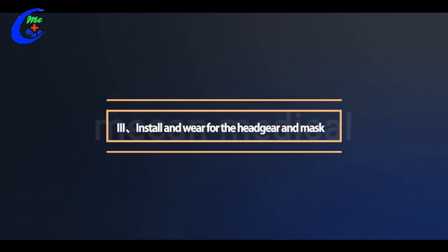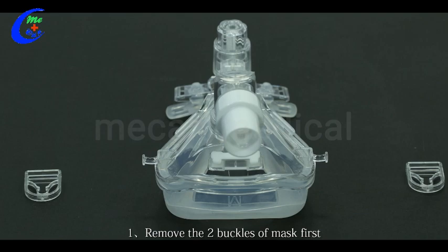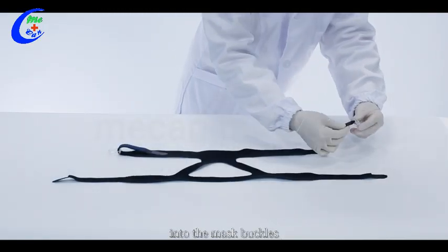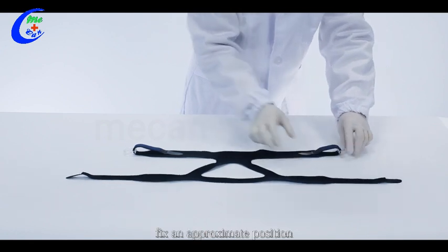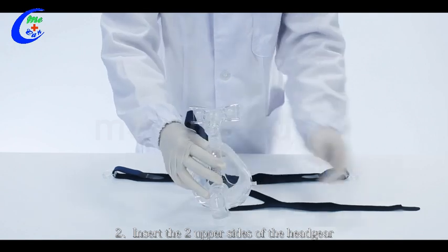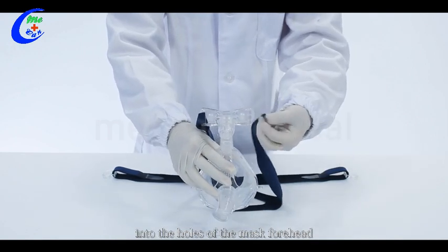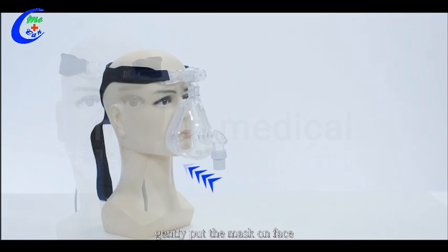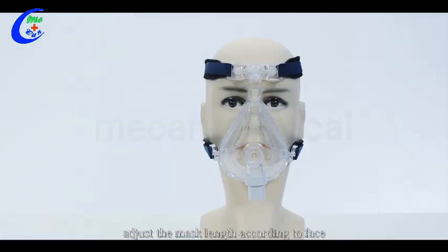Three, install and wear the headgear and mask. Step one: remove the two buckles of the mask first and insert the two lower sides of the headgear into the mask buckles. Fix an appropriate position. Step two: insert the two upper sides of the headgear into the holes of the mask forehead and fix an approximate position. Wear the headgear into the proper position on the head. Gently put the mask on face. Adjust the mask length according to face. Snap the two lower buckles into the fixing rods.